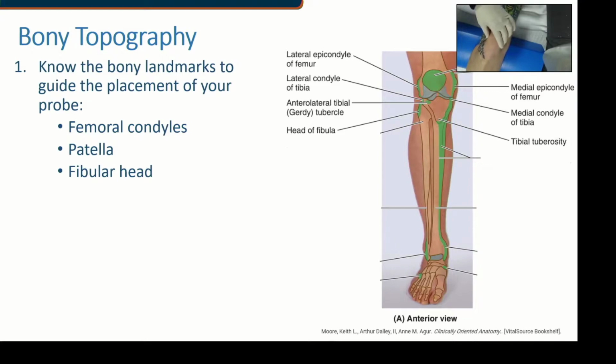Go ahead and let your knee relax. There we go. So it sits right on top, and it's going to sit in a groove between these condyles known as the trochlea. And we can actually see the trochlea and do some basic analysis of it when we're looking at it.